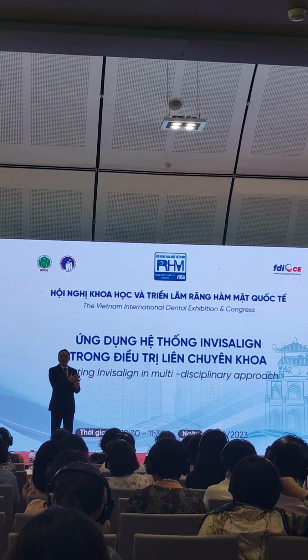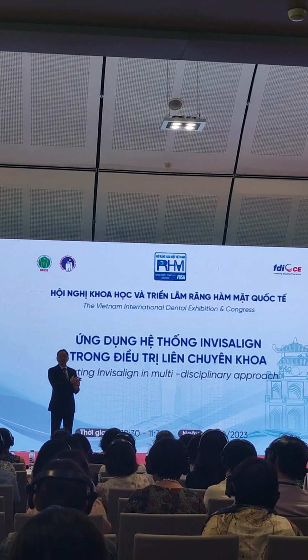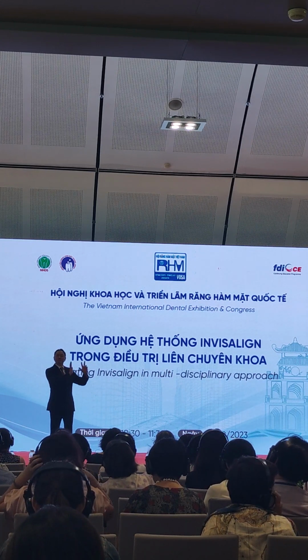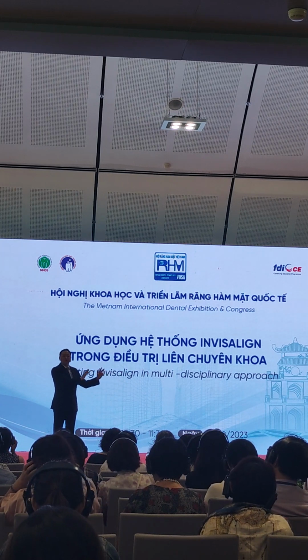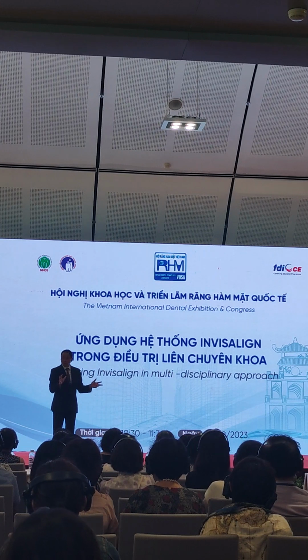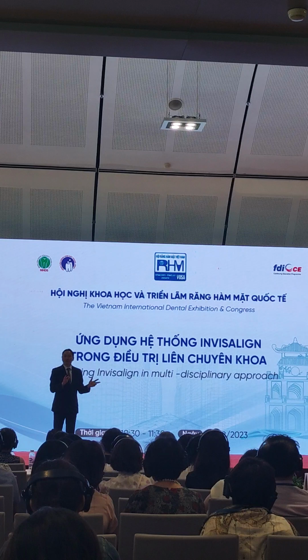Then the second reason is to help us control the elastics. The third is about the retention. If you maintain fitting, and we maintain good retention, it will help. Say for example, if you are going to distalize 2 molars or 4 molars, the anterior teeth tend to give you anchorage. True. Where is the contact point that delivers the anchorage?